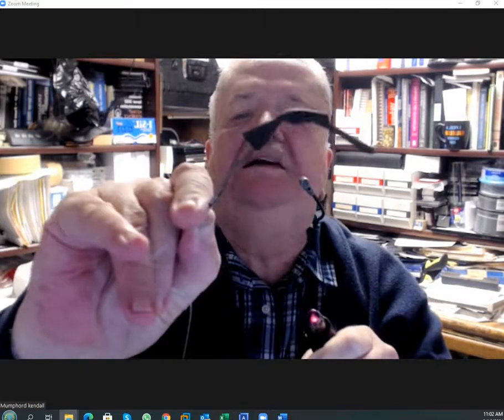All right, eventually you'll get there. It takes a little while to get it to shrink until it's small enough, but eventually it'll shrink to the point that it will fit, and eventually you're covering up that little barb that could be uncomfortable or maybe even damage your ear. And so that's why I have this little shrink tubing in here. Okay, it's coming in slowly. You may be able to tell that it's getting smaller.